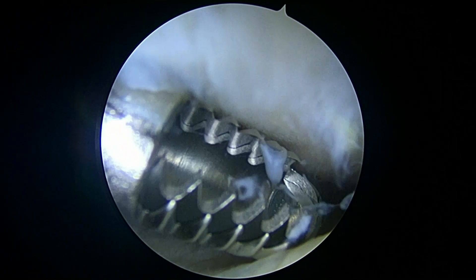We've got our 18-gauge spinal in position and we're going to slowly start to inject. I'm looking right here because a lot of times we can see this start to change colors once we get to about 8 to 10 cc's. We're at about 5 cc's right now — I can imagine it in my mind, but I don't really see anything truly objective yet, and we may not. That's all 10 cc's. We talked about maybe following up with a PRP injection in the office for the joint, but that's all of the BMC intraosseous. That looks good — so we know that we got it in the bone, not in the joint.